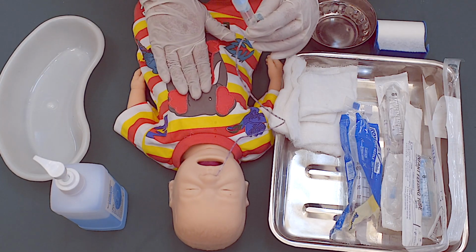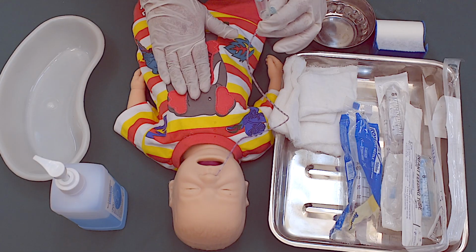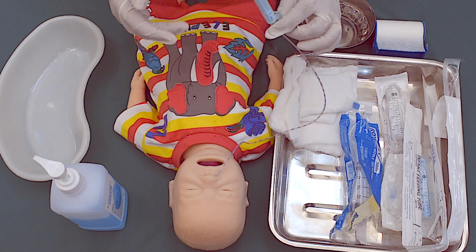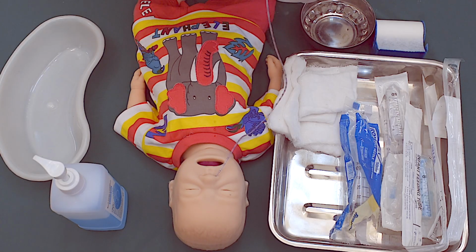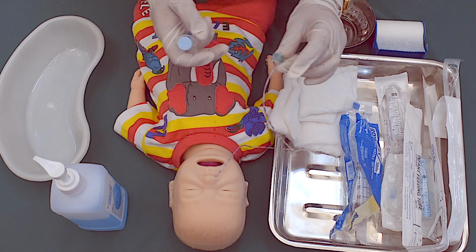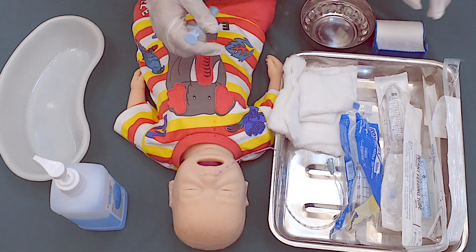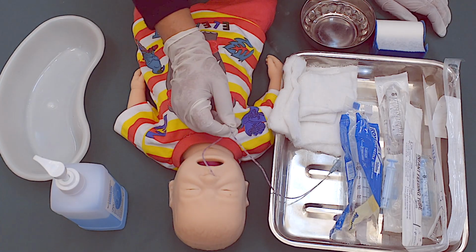The stethoscope has to be placed over the abdomen of the baby to listen to the gush of air. If that sound is heard in the abdomen, that means the tube is in the stomach. If no sound is heard, that means the tube is in the trachea. That tube has to be pulled out immediately.